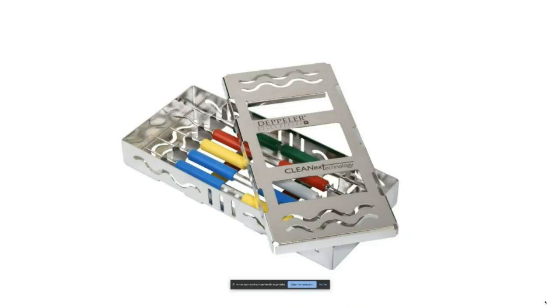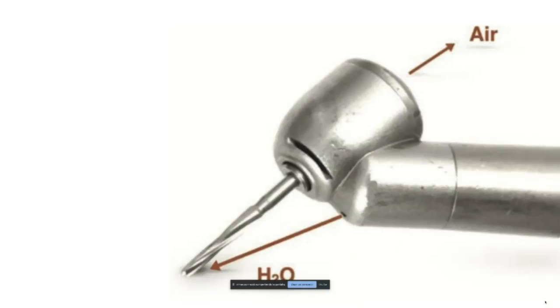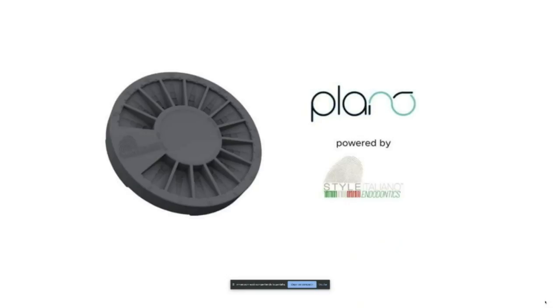Instruments to separate the tissue, to do some packing of the bioceramic materials, etc. So I recommend this kind of instruments always that you're going to make some microsurgery. And of course, we have to use also microblades in order to be more conservative to the soft tissue, okay? And also we need a handpiece, okay, in order to remove some part of the root or the bone.